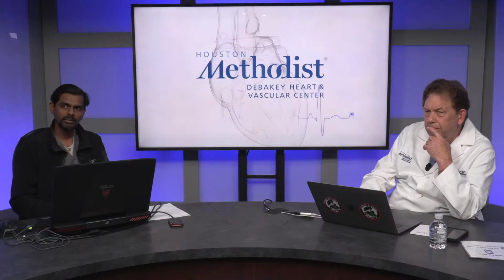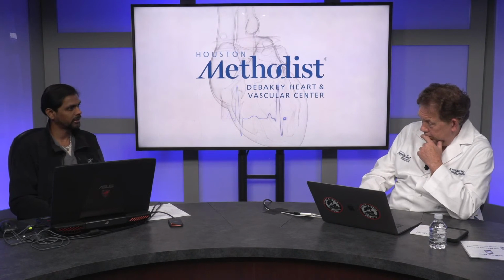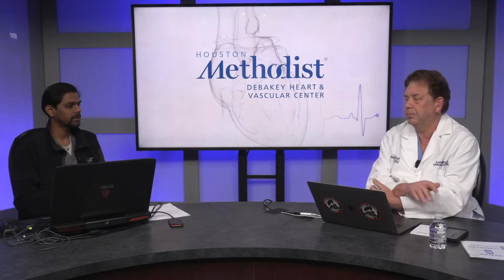So one other thing I would like to add here is, especially in a dynamic disease process like aortic dissection, in a non-urgent condition. If it's a type A, yes, we have to intervene urgently, but in a relatively uncomplicated type B dissection, I would make an argument that the best time for imaging is before we put the stent graft in.